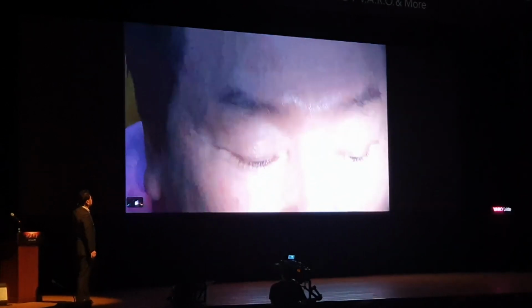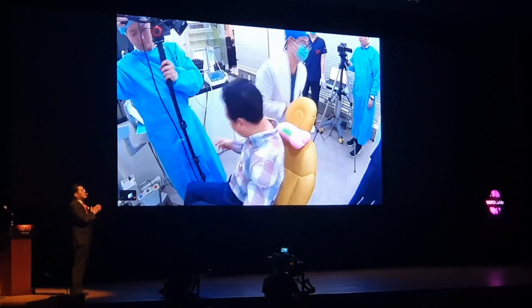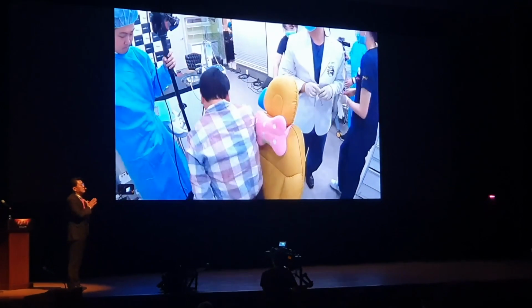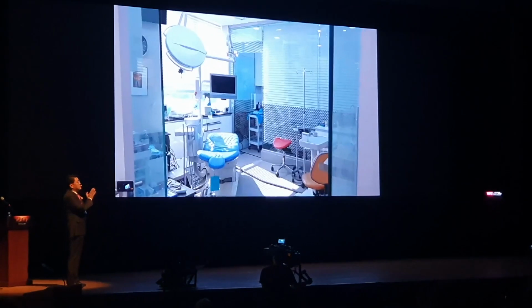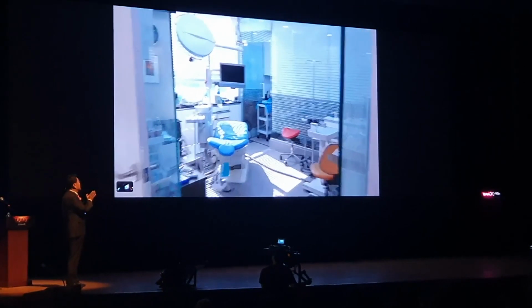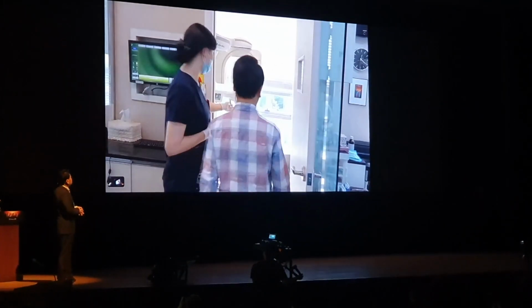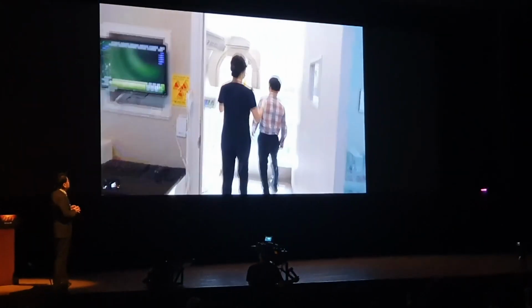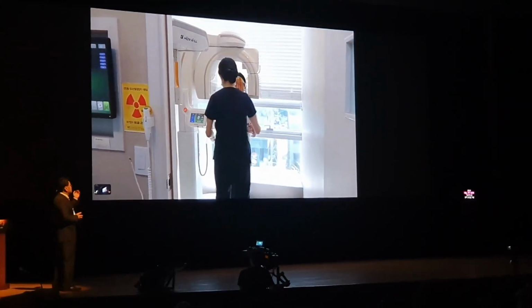Well, for now, Dr. Ho will go on to get a CT scan. The reason for placing a piece of gauze between the teeth during the CT scan is to prevent uneven bite contact that can slightly change the position. Now straight to CT scanning. He's entering the CT room while biting the pre-guide.